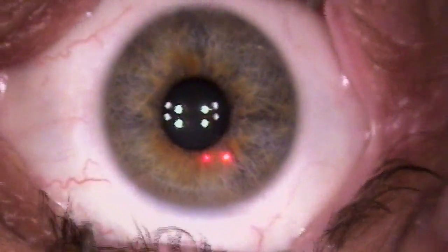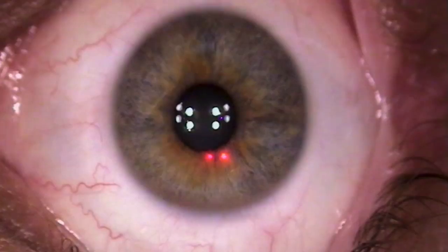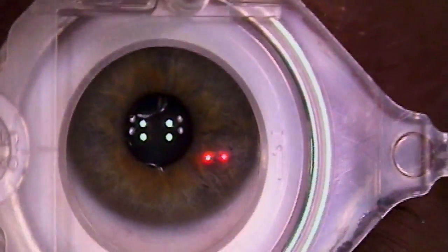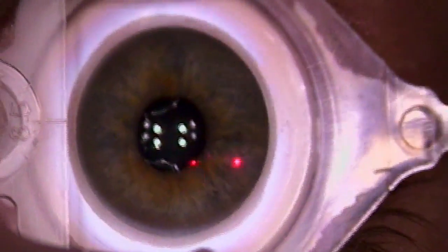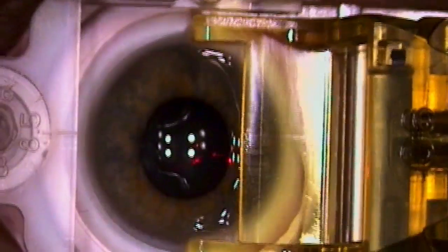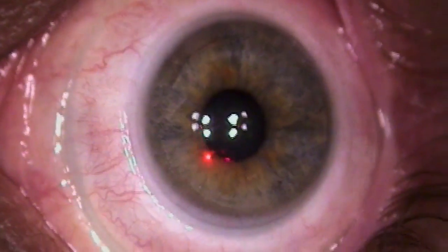Look right up at it as best you can while I hold your eyelids a little bit. Before I do anything, I want to test to make sure the drops are working. I'm just going to push, and when I push you're going to notice that everything gets a little dark. The green light goes away — good. And then you're going to notice the green light comes back on again.